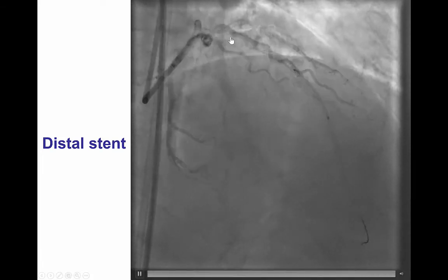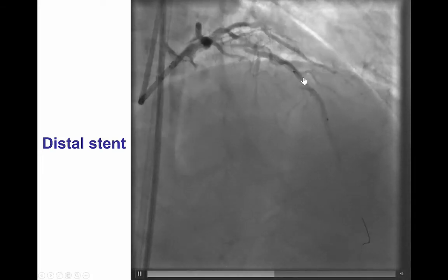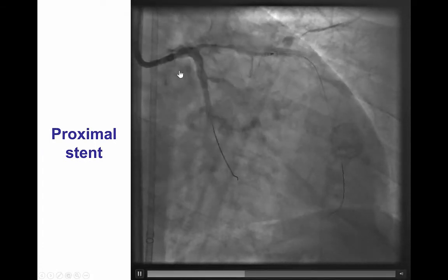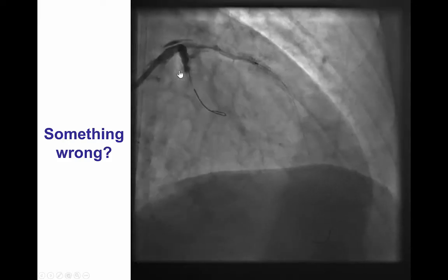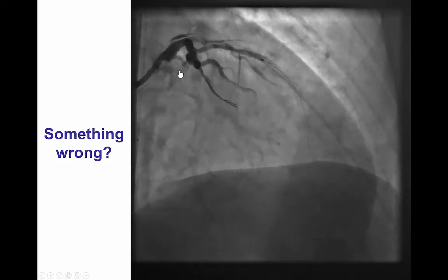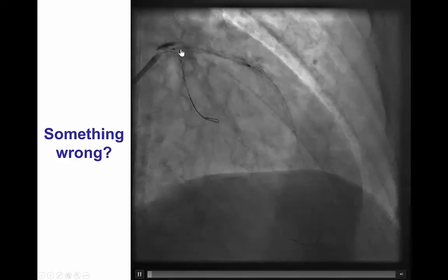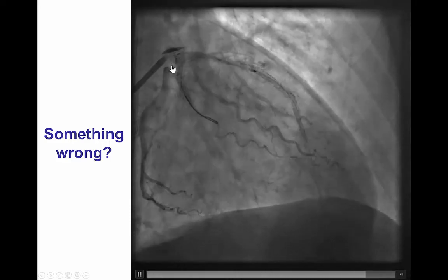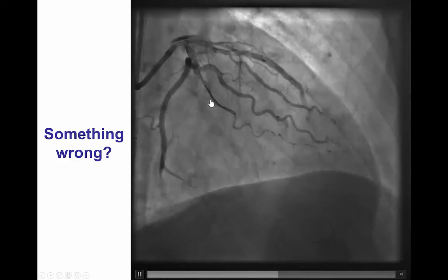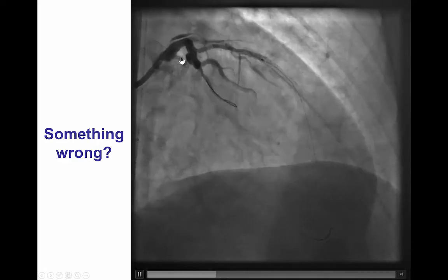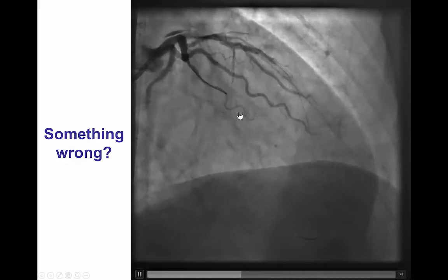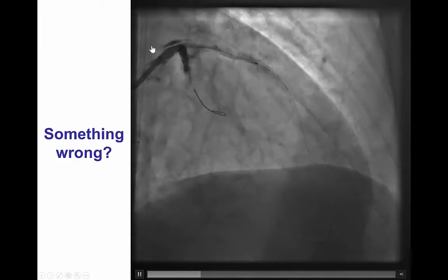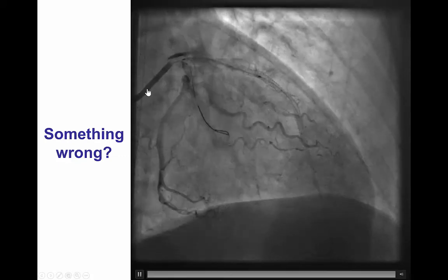We then went ahead stenting the remaining LAD, placing a stent distally and also placing a stent proximally all the way to the ostium of the LAD. Unfortunately, by placing the stent at the ostium, we did develop a dissection of the proximal LAD extending into the left main — an unfortunate second complication. The good news is that we have a wire into the circumflex, so we protect both vessels, LAD and circumflex, in case this dissection expands and causes left main compromise.